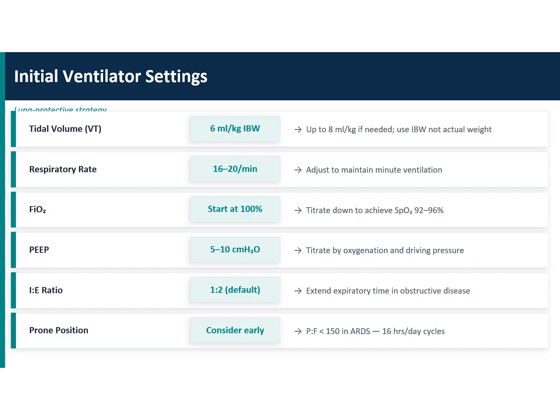So baseline, if the patient is very tachypneic, you probably want to start around that respiratory rate, not more than 30. You start with a higher FiO2, then you can always come down. You start with a PEEP using probably the ARDSNet PEEP table and then adjust it. The ARDSNet PEEP table is one of the very primitive ways to adjust the PEEP.